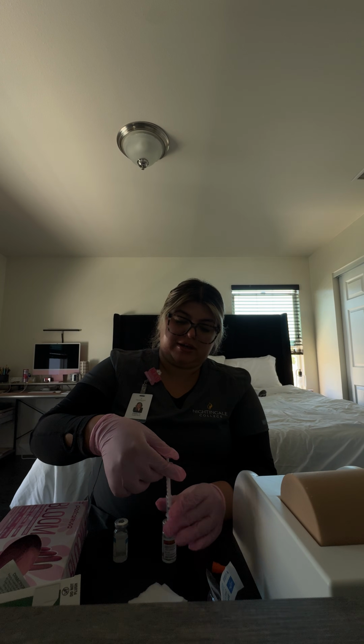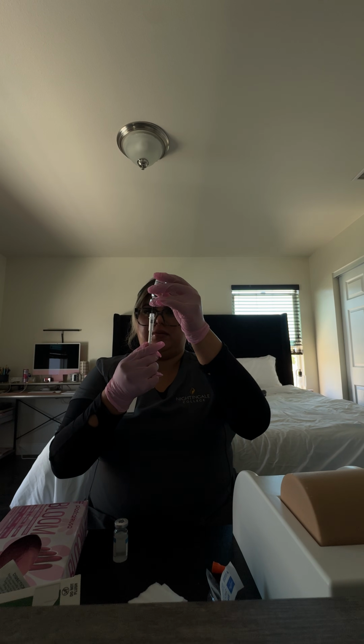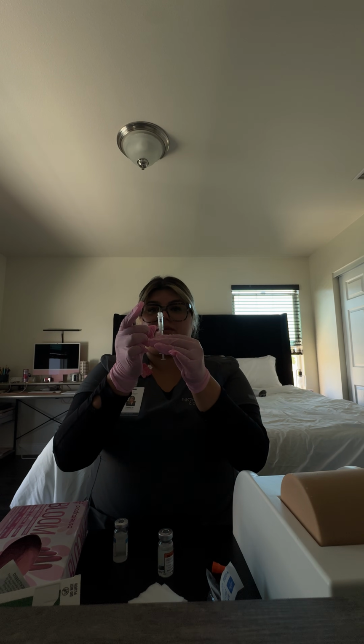We're going to inject the air, and now we're going to invert, and we're going to draw up the 4 units of insulin. Once we have drawn our 4 units of regular insulin, we're just going to flick off any air bubbles that we see in there, and then we're going to verify the correct units against the EHR on the computer. So we need 4 units of regular insulin. We see it is 4 units on here.